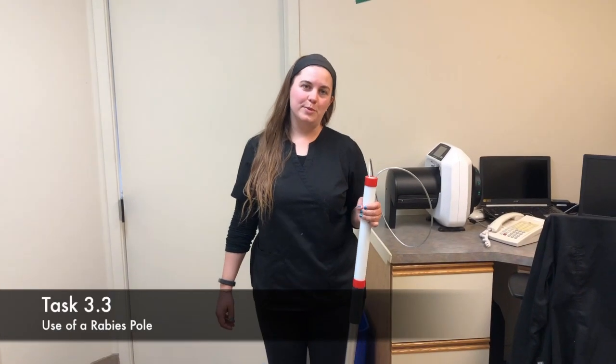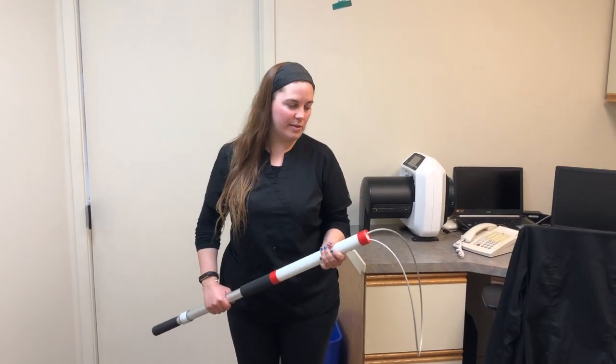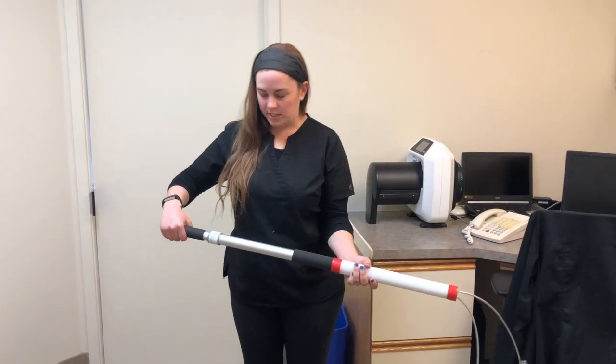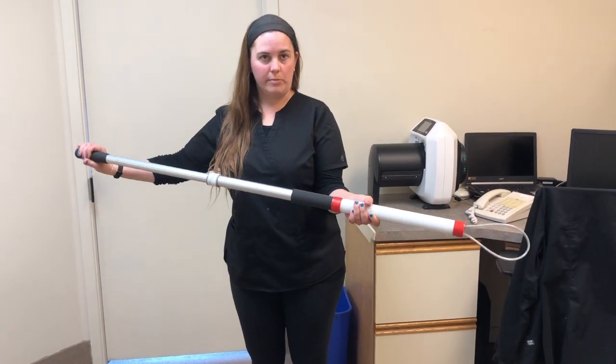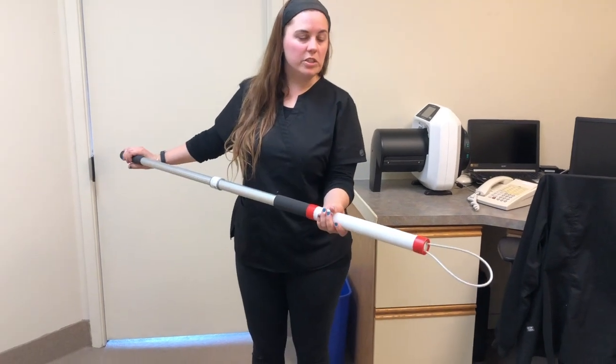So when using a rabies restraint pole, you want to be very careful that you don't hurt the animal in any way, because it can close on their neck pretty tight. The way this one is used is it's a twist one. So you twist the handle and pull it to the length, and then you can lock it by twisting it back the other way, which is really nice. Then you can move the animal where you need to.